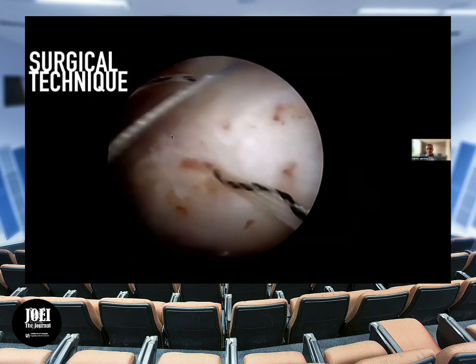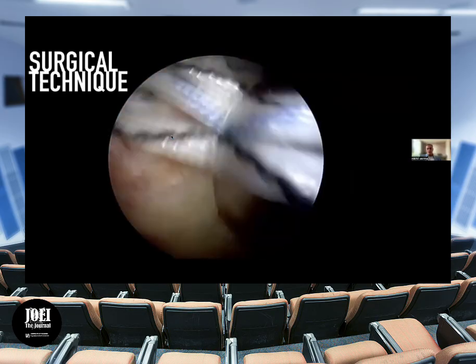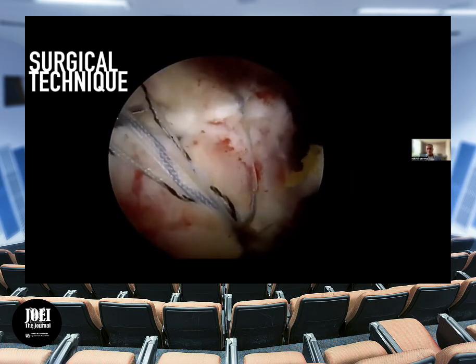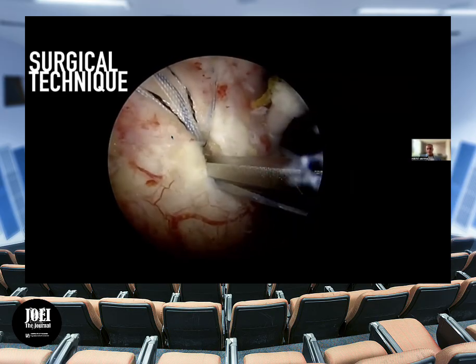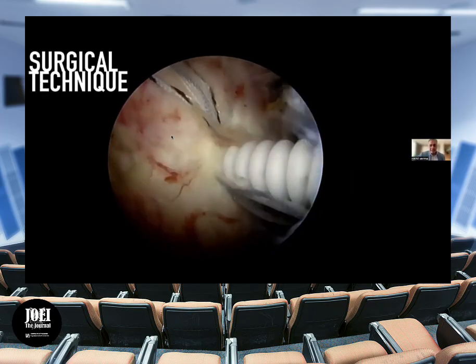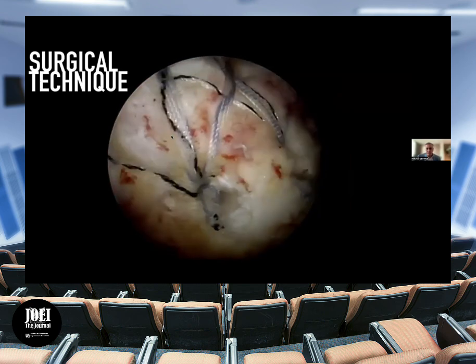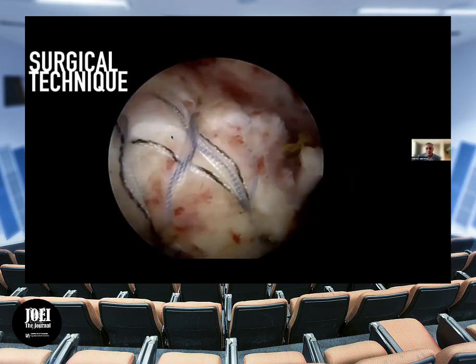And that's it. Now you go back and simply finish your rotator cuff repair. You've already got your sutures in place, and you then dock them into your lateral row, if you're doing a lateral row repair. For those surgeons who like to do a single row repair, they can integrate the anchor into the DBM implant to provide the same amount of coverage, and the case is finished. We're now thinking about how to load the implant, potentially with things like bone marrow aspirate concentrate or PRP for further biologic activity. This is what it looks like when it's all done, your standard bone tendon repair.